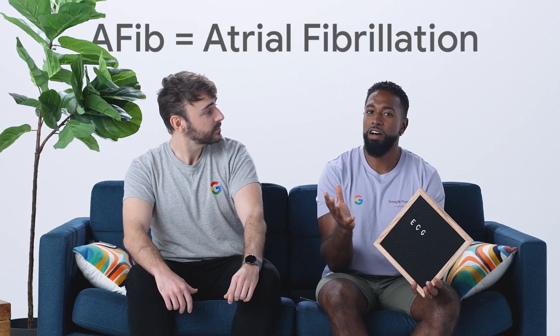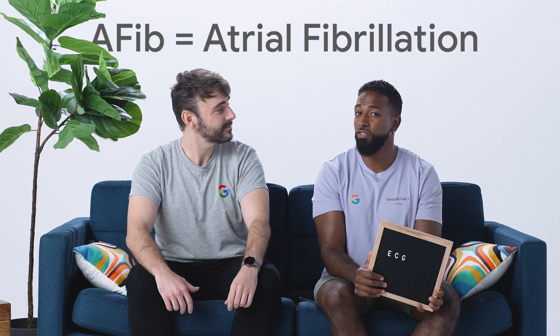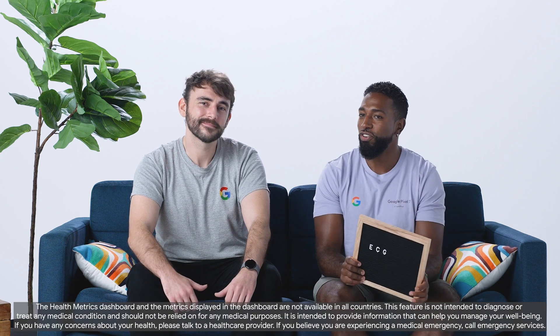During atrial fibrillation, the upper chambers of the heart contract irregularly, increasing the risk of heart attack, blood clots, stroke and other heart conditions. Which is why the ECG app on Google Pixel Watch is so helpful — it assesses your heart rhythm for AFib and makes it easy to share your results with your doctor.